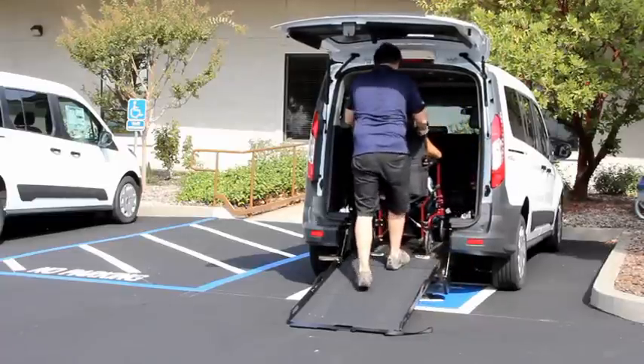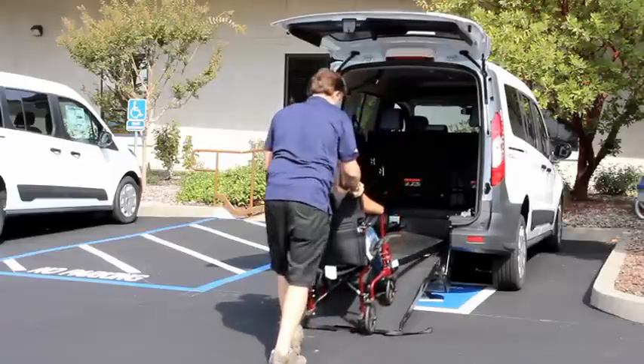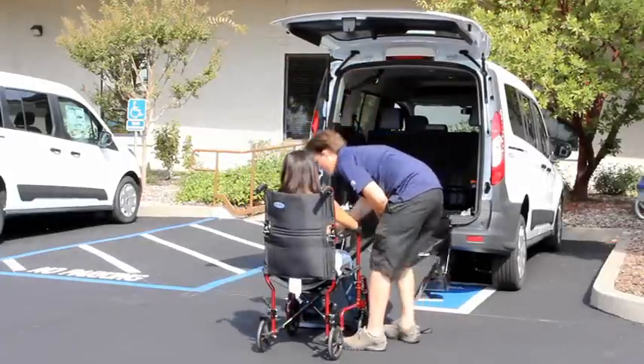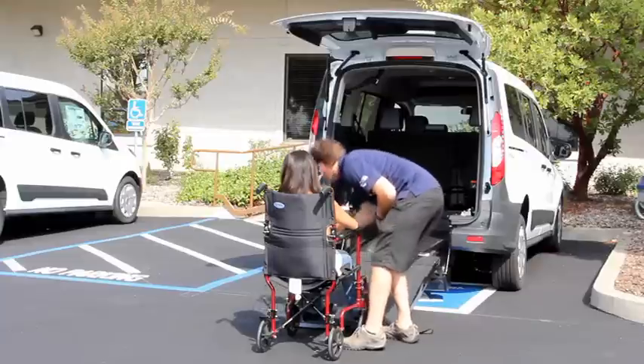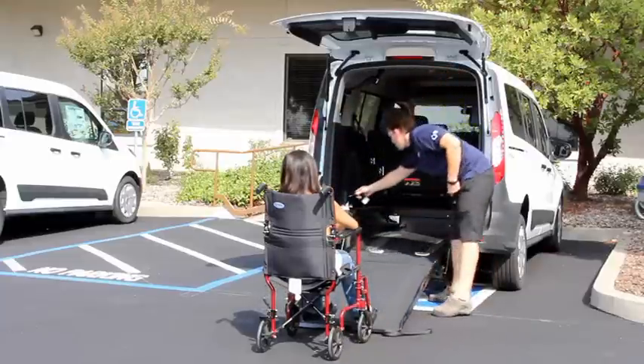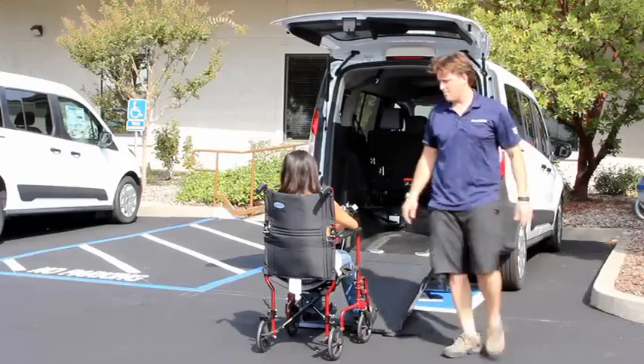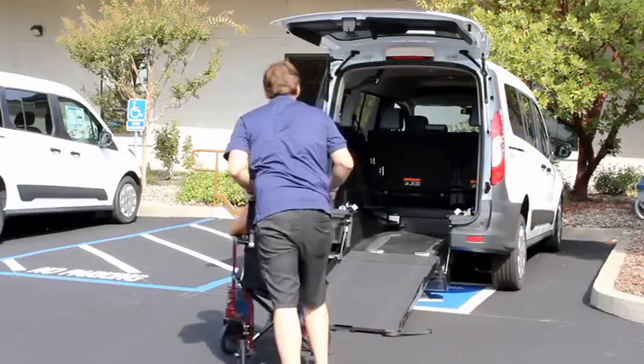With their engineering and manufacturing capabilities, we are pleased to offer a specialized conversion featuring a 31-inch wide flat folding ramp with a weight-carrying capacity of 800 pounds. NorCal Vans and Transfer Flow are happy to share this easy-to-use ramp with you.